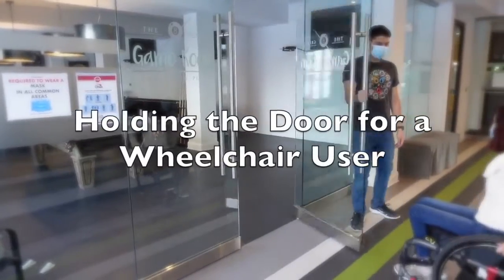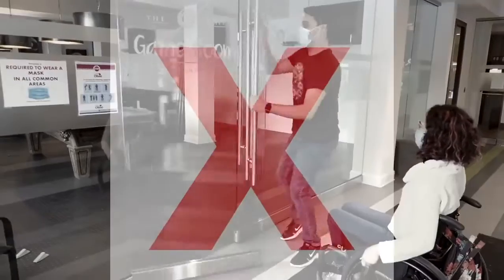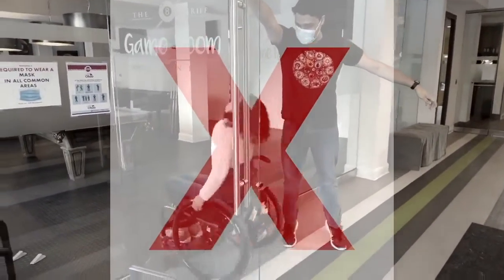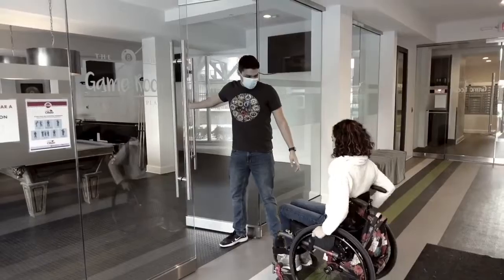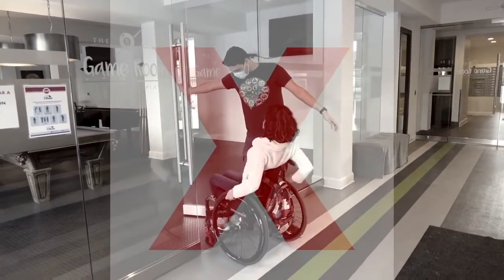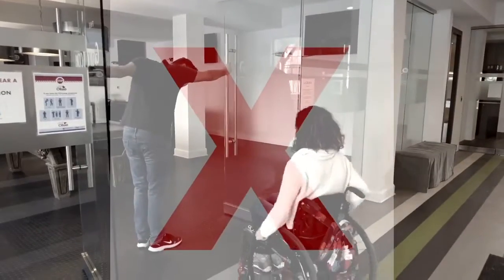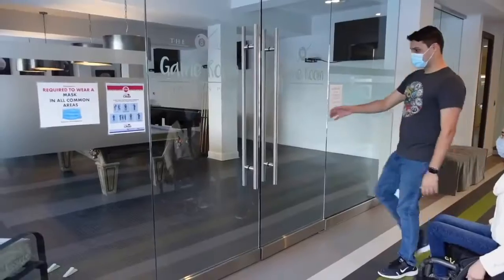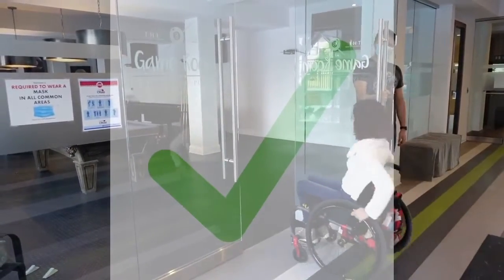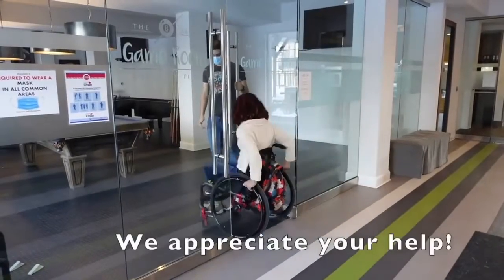Holding a door open seems fairly intuitive, but there are ways to make it easier for a person in a wheelchair. It is always so uncomfortable to travel underneath somebody's arm, especially if they're pretty short, and it's best if you can just find the best position for you to stand so you can be the most out of their way. This involves opening one door in a set of doors and trying to tuck yourself behind it so that you stay out of the way.